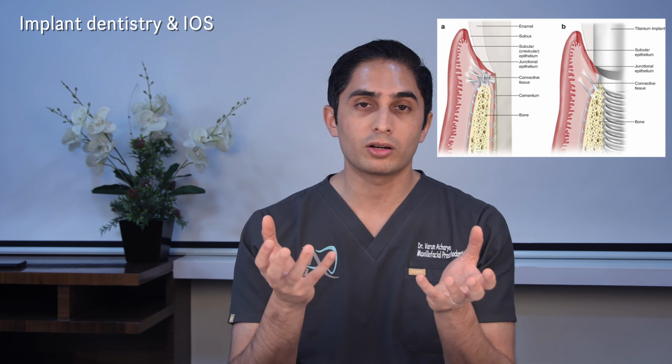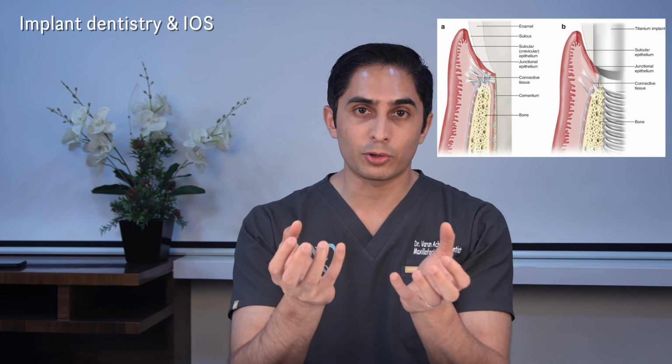Think about how a scanner works. A scanner takes multiple images and stitches them together to give you this 3D composite image. And in that stitching process, minor errors are created. Now, that's not so much a problem when you're dealing with teeth because you have your periodontal ligament, which moves around to compensate for those errors. But implants don't move. And if implants don't move, you're now going to have an input, which is your scan, which has an error, and thereby your output will automatically have an error, and so your bridge, you may encounter a rock.